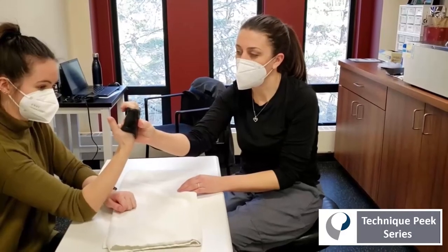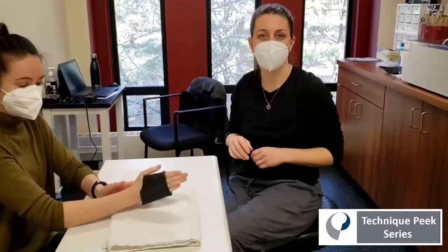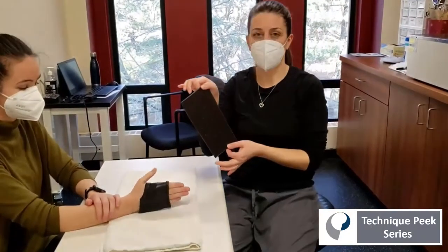Now I'll show you how to make this with a small piece of material that you probably have lying around the clinic, so it's a very cost-effective splint to make using a piece of material you would otherwise throw out.